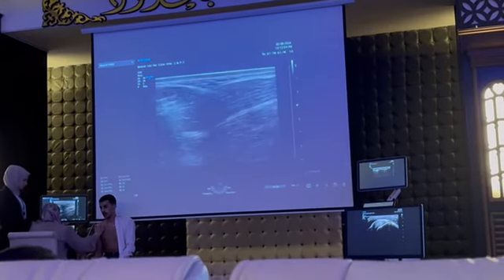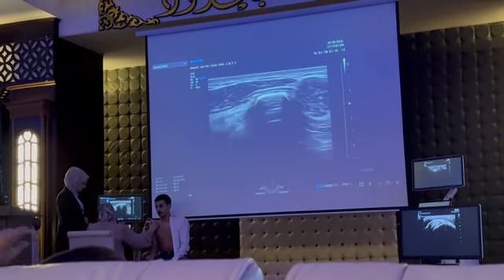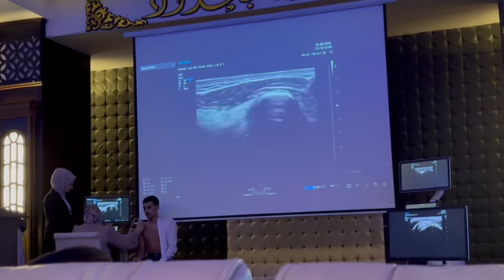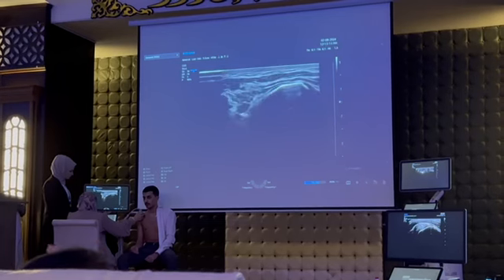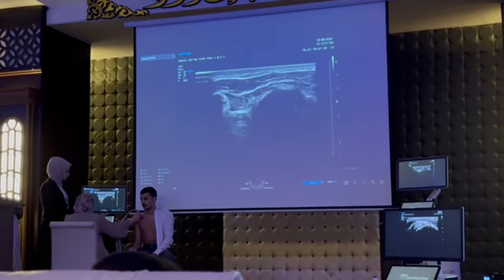Then I also go to it laterally. Then I do fanning of my cranial part toward the medial side. But I should see the clavicle now, okay? So I make it toward the medial side. You see? This is toward the medial side. Just make fanning.